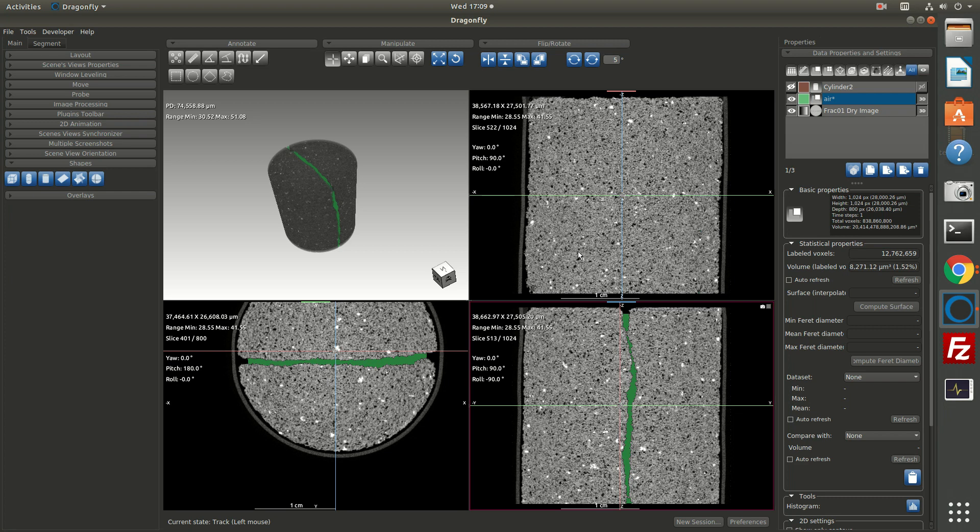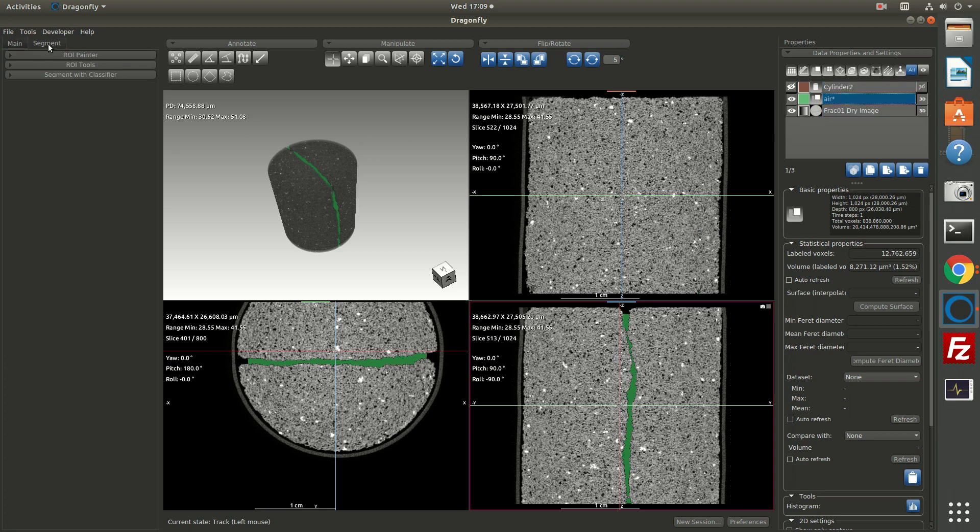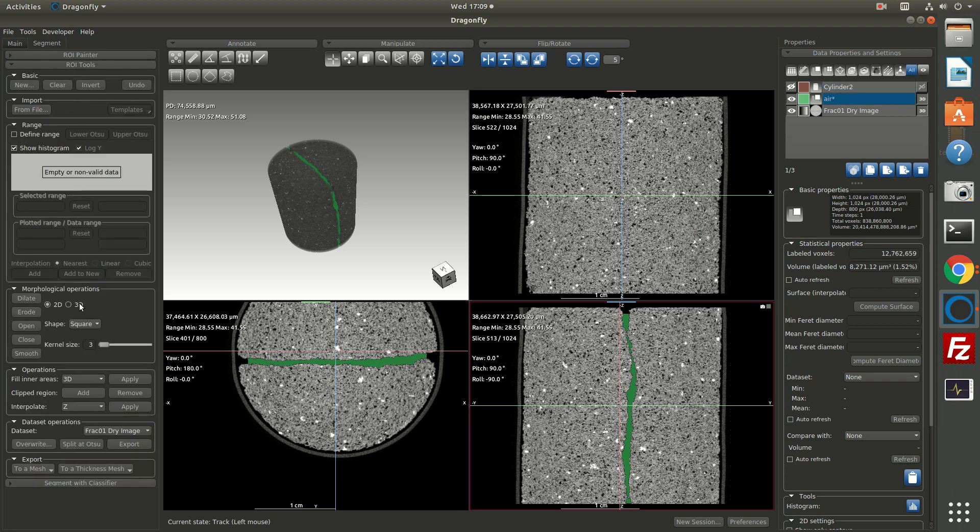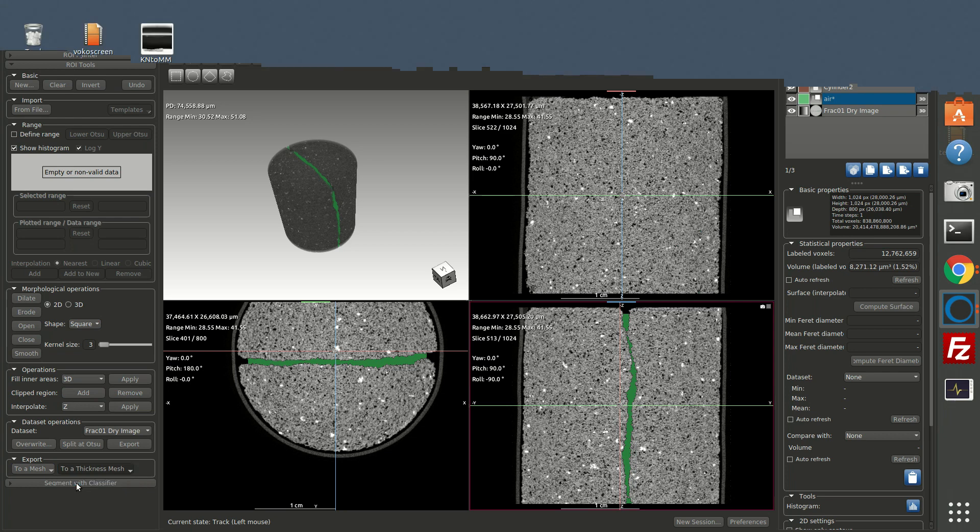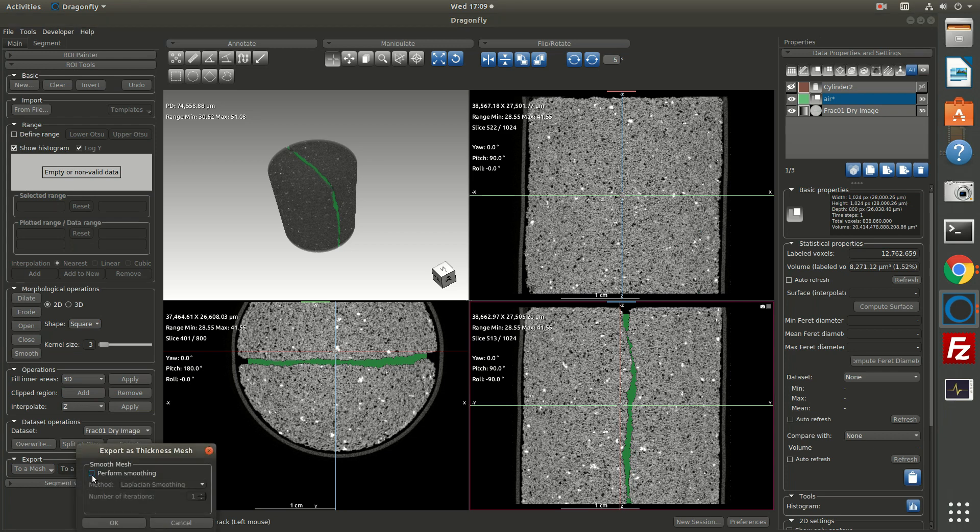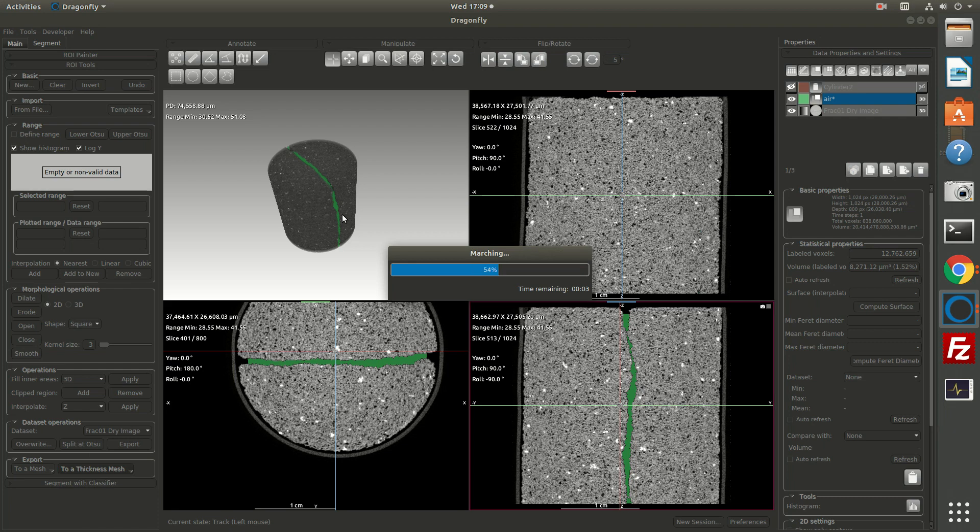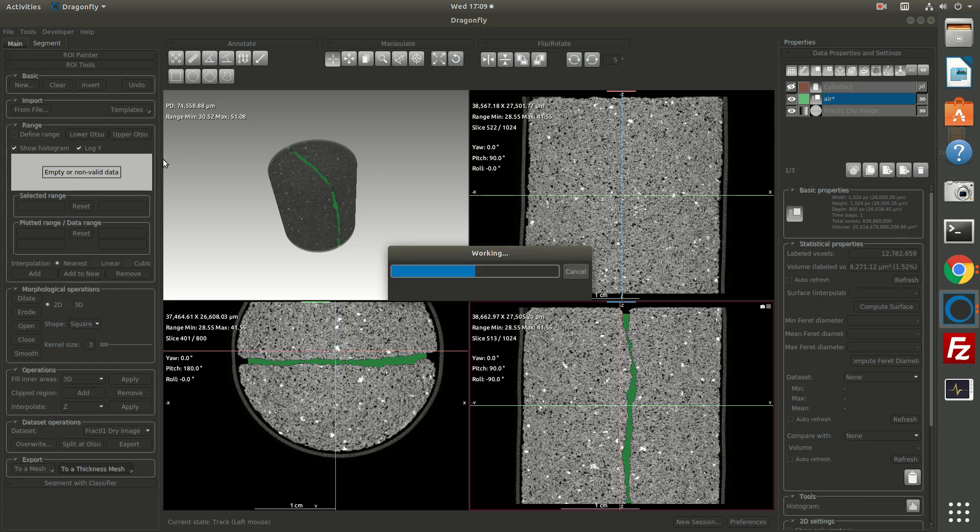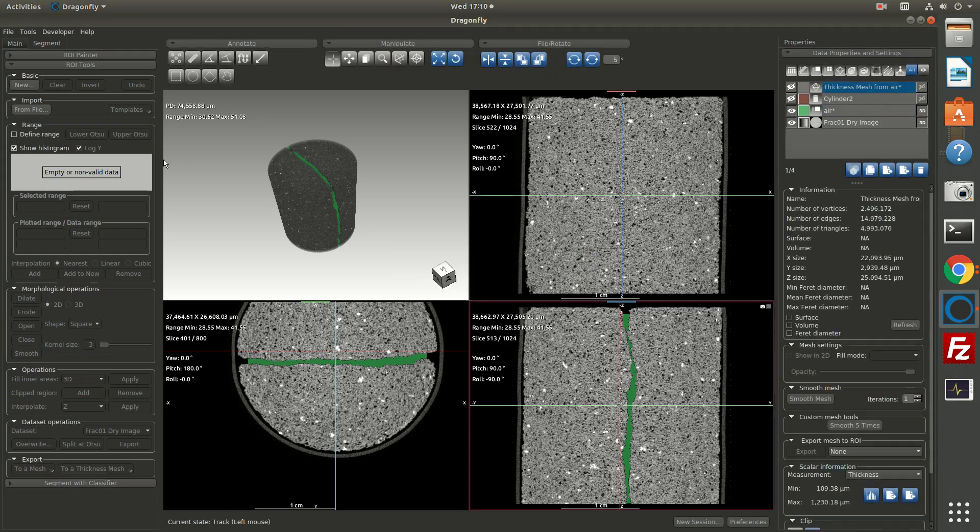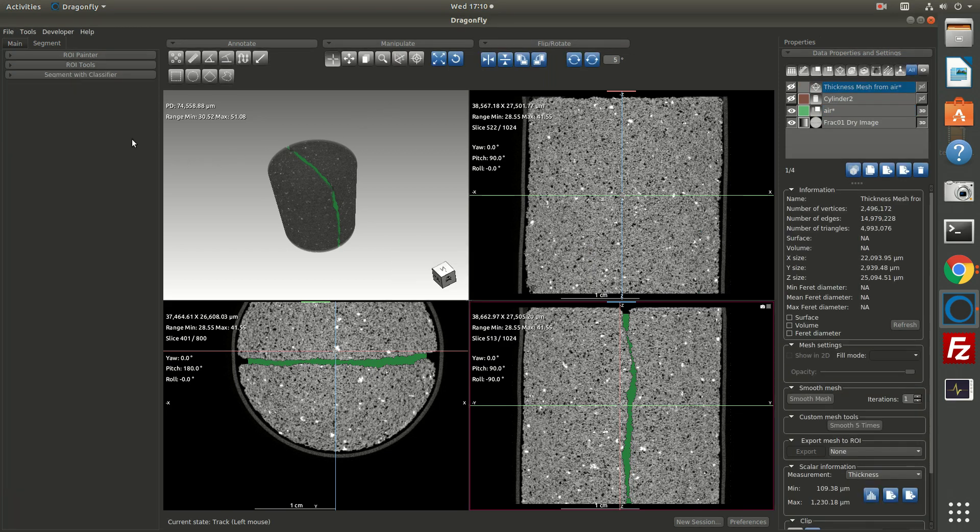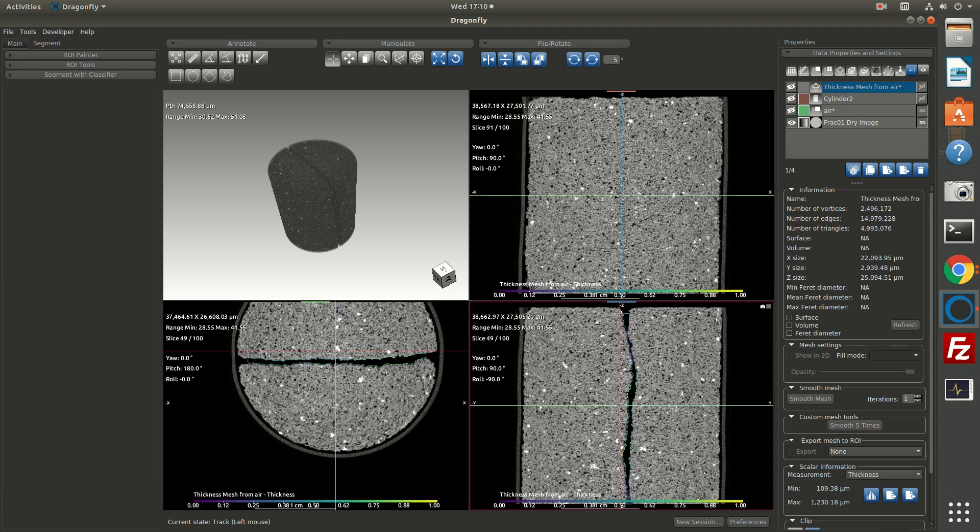The last operation we'll do in this demo is create a thickness mesh. So if I select the air ROI and I go back to the segment tab, you will find on ROI tools an option near the bottom to create a mesh or to create a thickness mesh. I'm going to tell it I want to create a thickness mesh with some smoothing and click OK. That's going to take the ROI, and it's going to create a new object in our workspace, which is a mesh. All right, the mesh is computed. I'm going to minimize ROI tools.